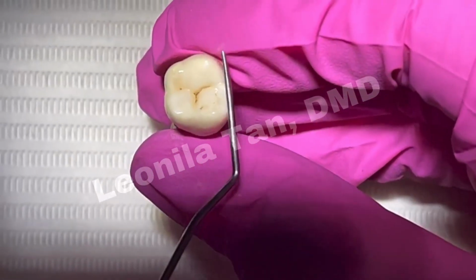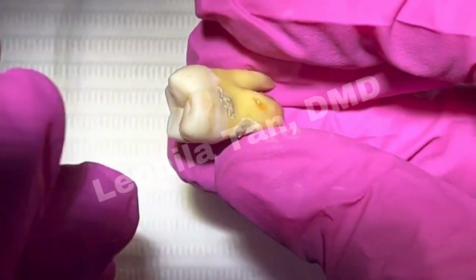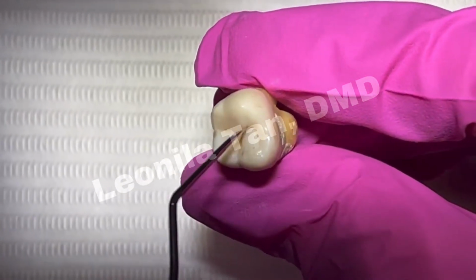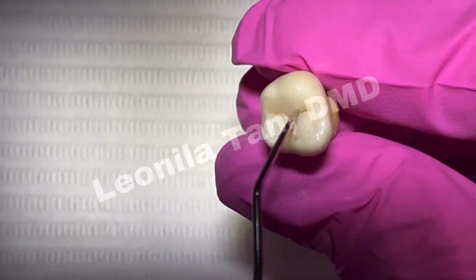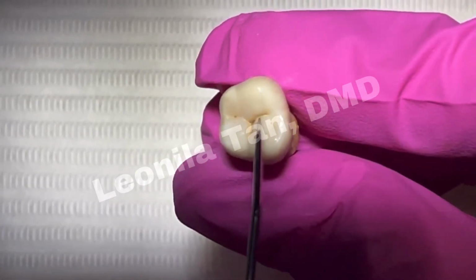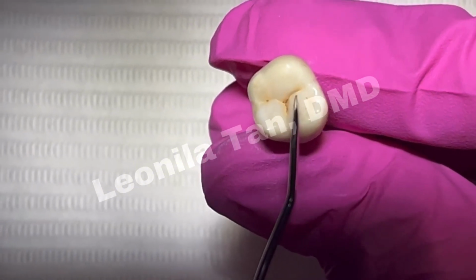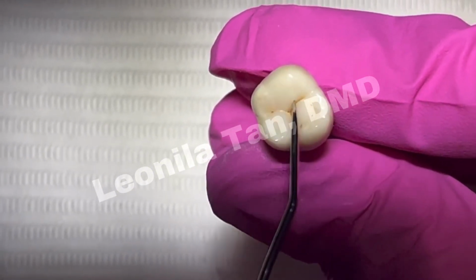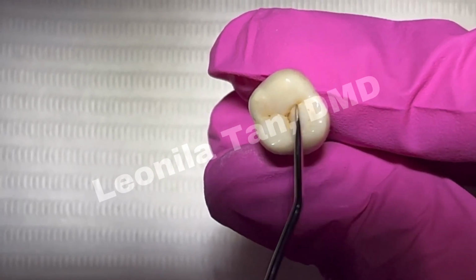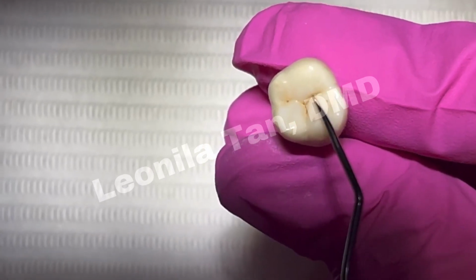Why is it very important to understand the orientation of your burr? Because if you look at the anatomy of the mesial side, with the wrong direction of your burr, if you direct it mesially, you will easily perforate the mesial side. So notice if this is the burr, it's directed almost parallel going towards your palatal side. Never in that direction or to the distal.